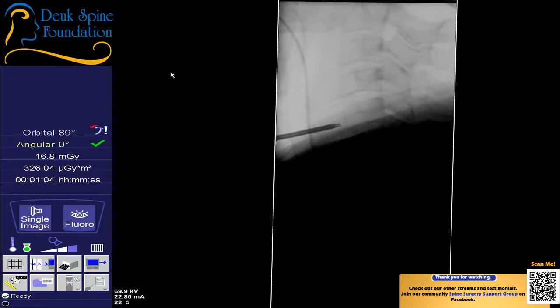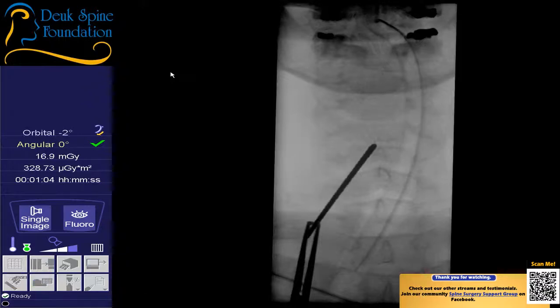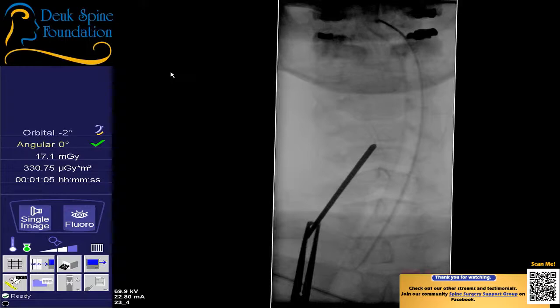Whew. All right, move the fluoro north a smidgen, quarter inch, and give me an AP. No, we don't need a shoulder pull. No shoulder pulls, just an AP. I can handle it myself. Shot. Okay, a little to my side. Need to be back to the middle. And shot. Perfect. A lateral.